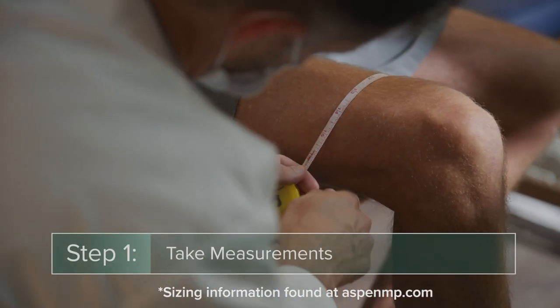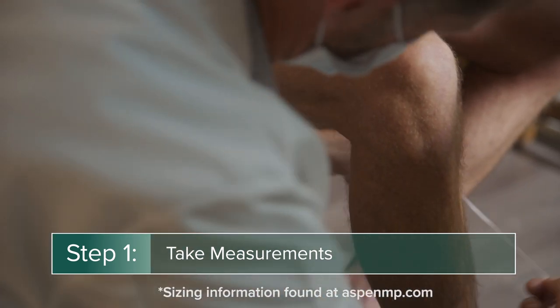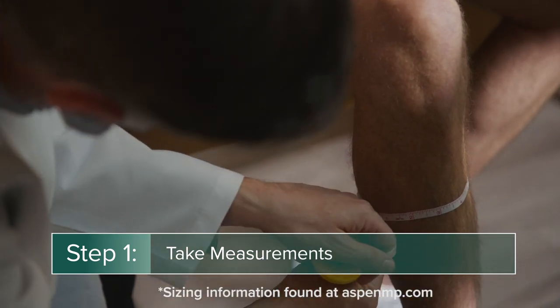A clinician will measure the patient's thigh and calf both six inches above and below the patella to determine the proper brace size.